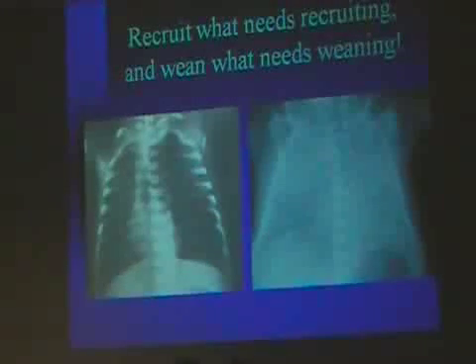So otherwise, you're following your SATs and your FiO2, remembering that when you're at optimal mean airway pressure, your FiO2 will be as low as possible. Anton van Kamp from Amsterdam has some beautiful data where he takes kids with RDS, because in his nursery, it takes forever, even longer than here, to get his surfactant. I keep talking to him and saying, Anton, why don't you give your surfactant early, and he says, I can't get it from the pharmacy.